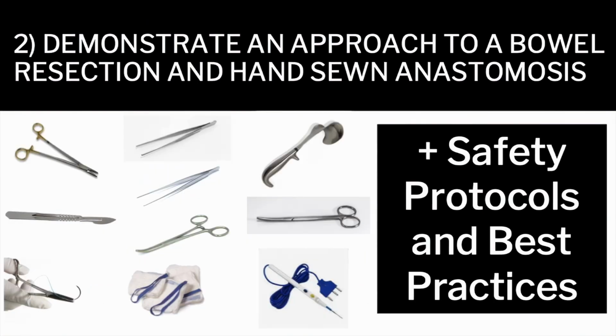You will need a needle driver, scalpel, sutures, forceps, toothed and non-toothed, retractors, Metzenbaum scissors, electrocautery, and non-crushing clamps if available. Alternatively, the strings can be cut from laparotomy pads and used as ties if non-crushing clamps are not available.